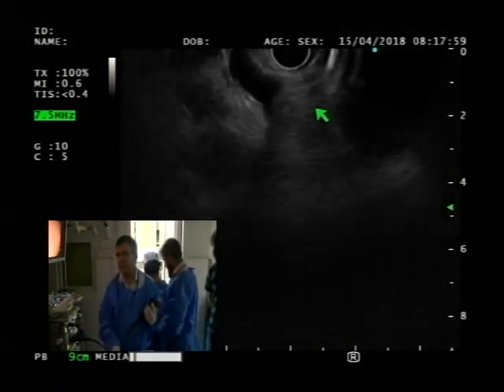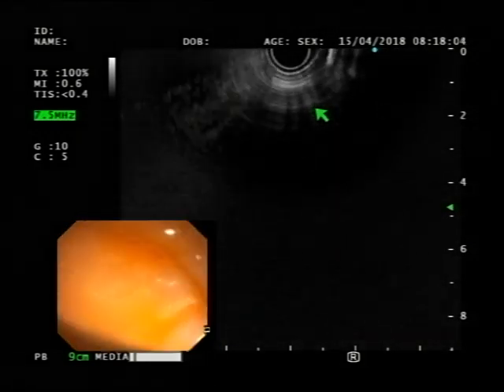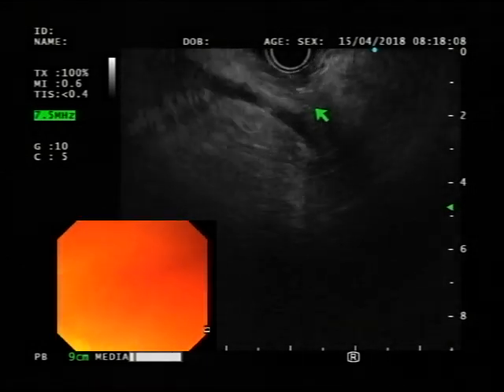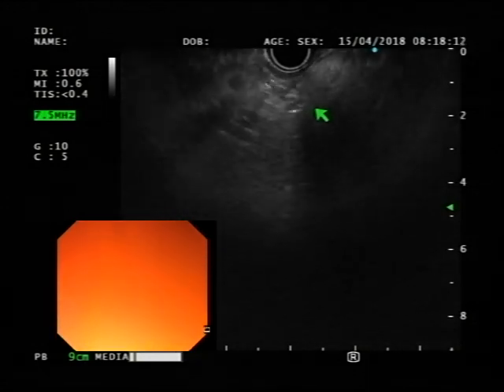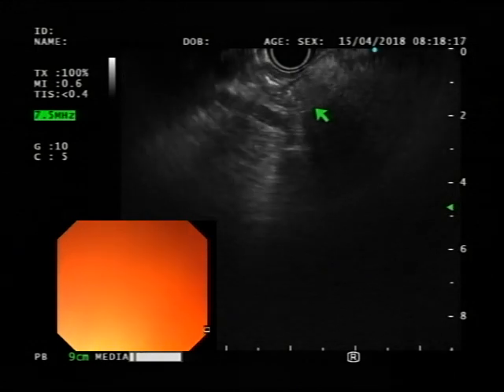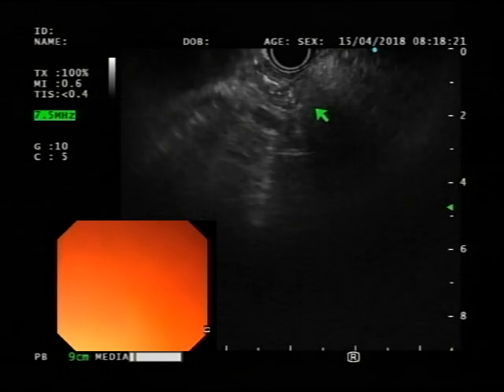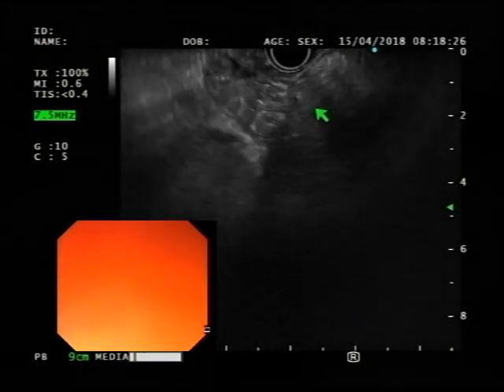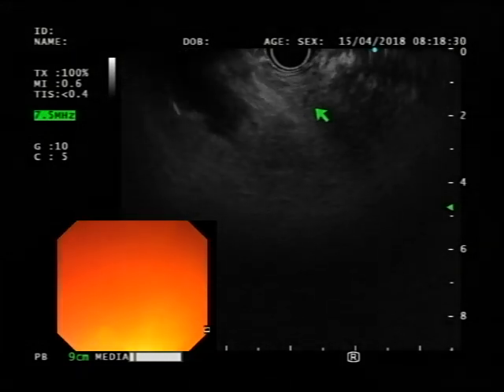Let me go to the second part and let me take another look from that side, just to make sure. So when there is a confusion about that, like there is no mass, then you really have to be more careful and take a look at the pancreas from all the different angles. Bilirubin is 0.1. And Khalid, is there a note there? Let me take a quick look. Okay, so all the LFTs are normal, completely normal, no problem anywhere.